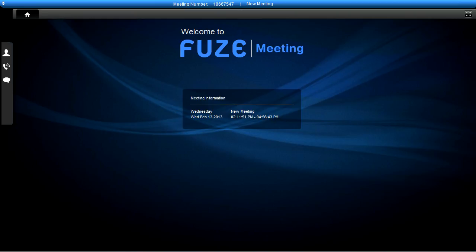Okay, well, Roger's got my details, so if there are any little questions, don't hesitate to ask. And as Roger said, even when I'm not up here for a while, it's quite easy to do a remote session, where we can both see the slide at the same time and see if we can help and that sort of thing.